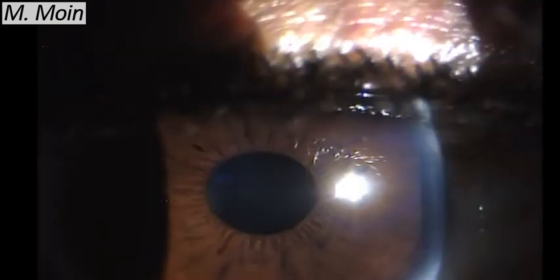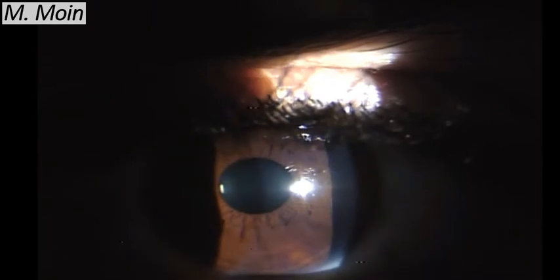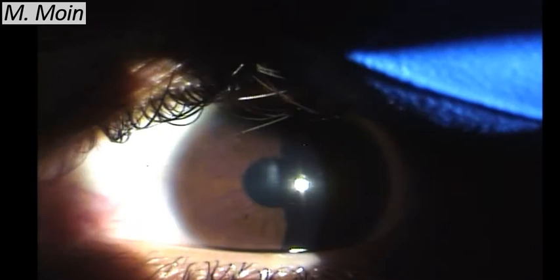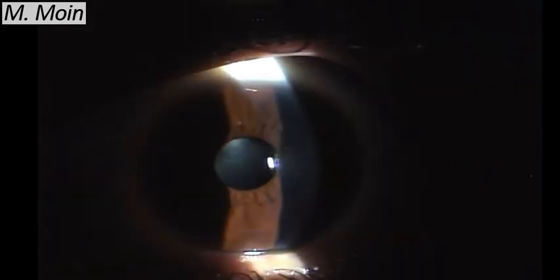The things we want to see include any Vogt striae and the Fleischer ring, which I'm trying to visualize. Making a slit and looking at the profile, we check for any Fleischer ring. The other important thing is the corneal contour — this is the front and this is the back — and in keratoconus this contour becomes more conical. That is the key difference to look for.